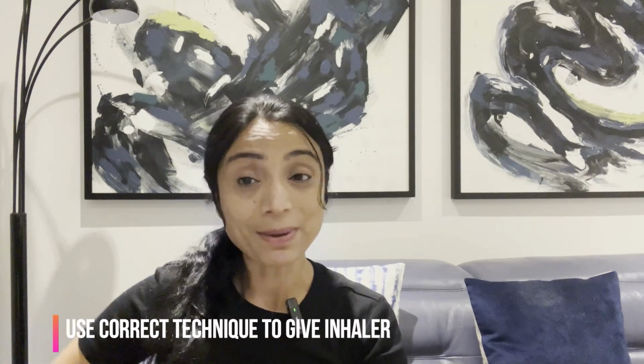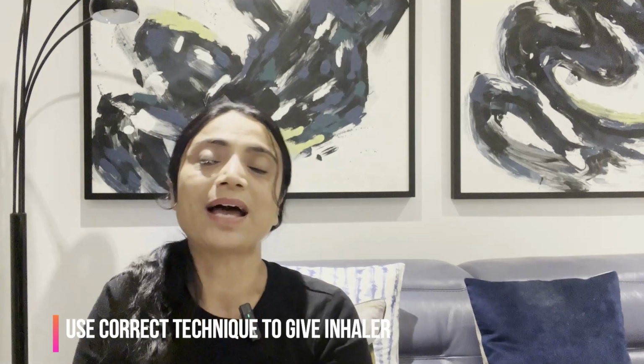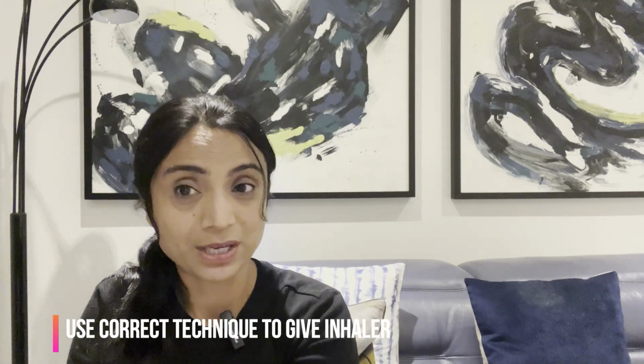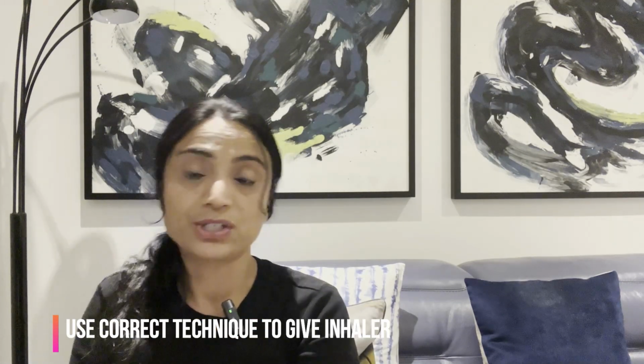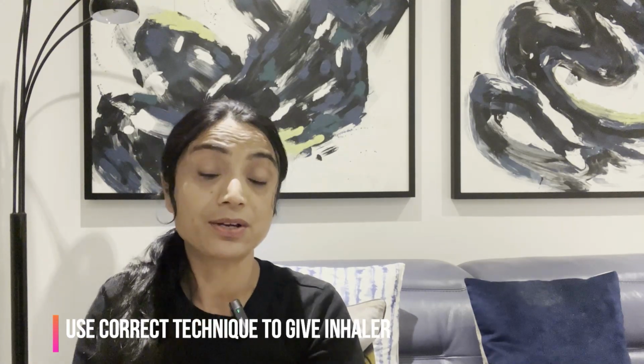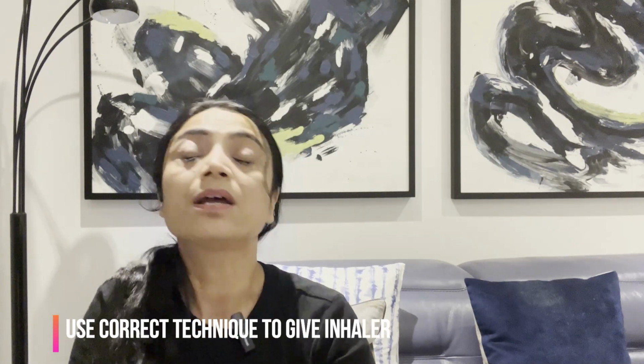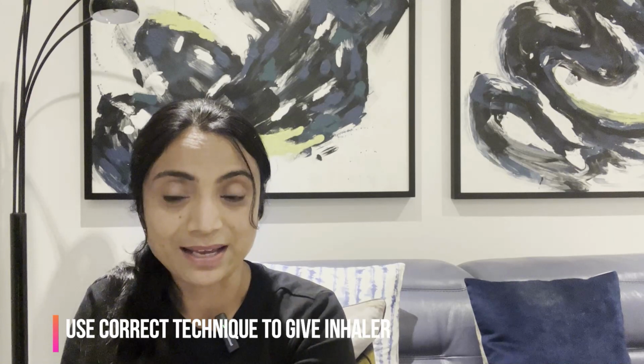Now, moving on to number 6, which is obviously our technique. That's the bit I'm going to show you in the video clip, how to use the correct tidal breathing method to give that. So I'm going to start the video from there, where I have done all the checks: the drug check, the prescription validity, the ID check. Now I'm ready to give this using the tidal breathing method. So I'm going to show you that clip there, okay?